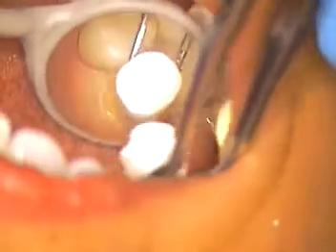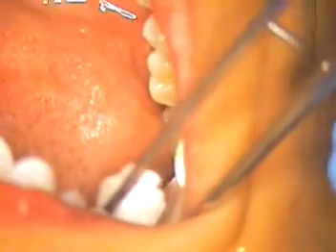So we'll bring you back in for the impression, show you how I do that. And go ahead and close down for me. That's it. Just have her closing on that, compressing. Keeps the space in there too. And we may change the triangle in there next as well.